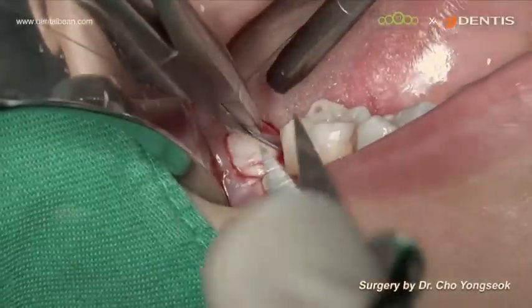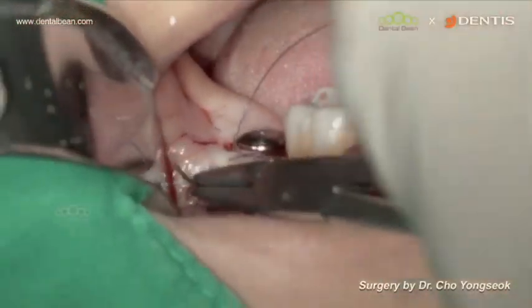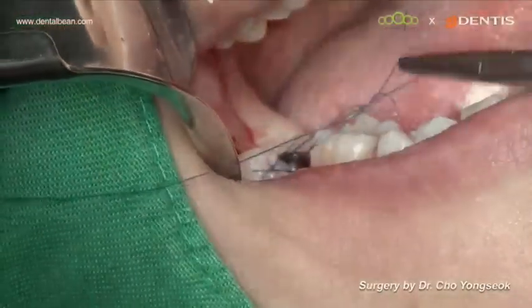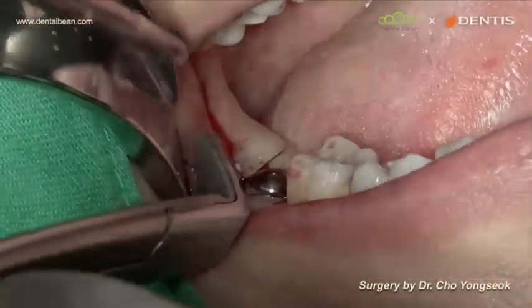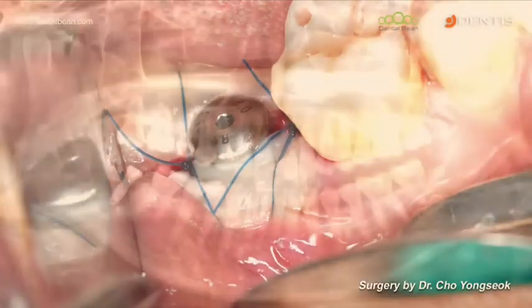One more. Modified external vertical mattress suture was done. Okay, and the surgery is finished.